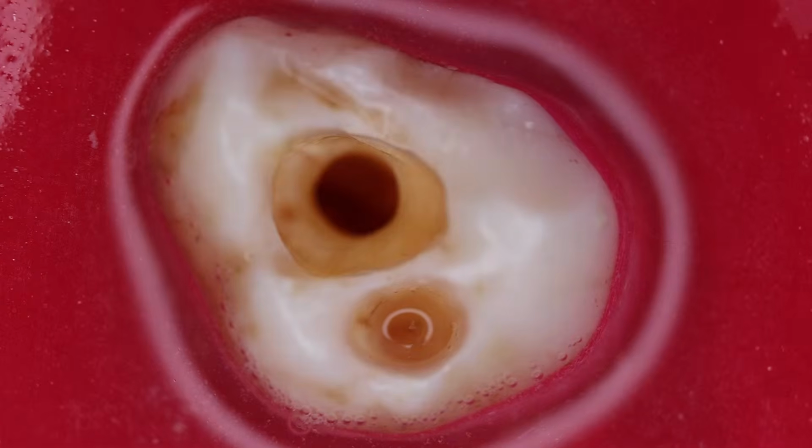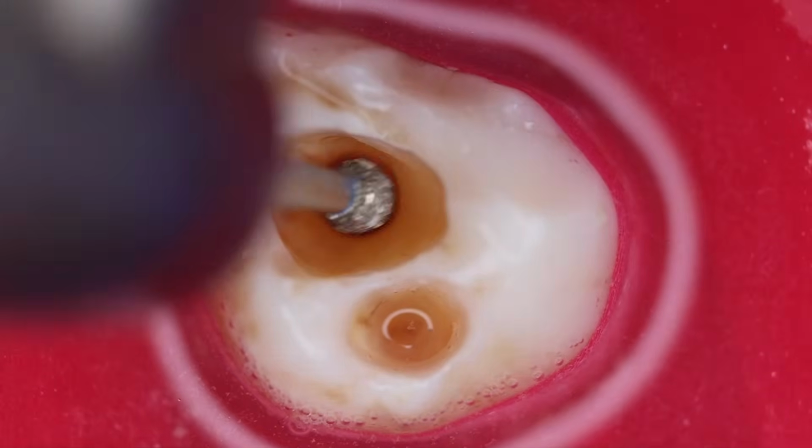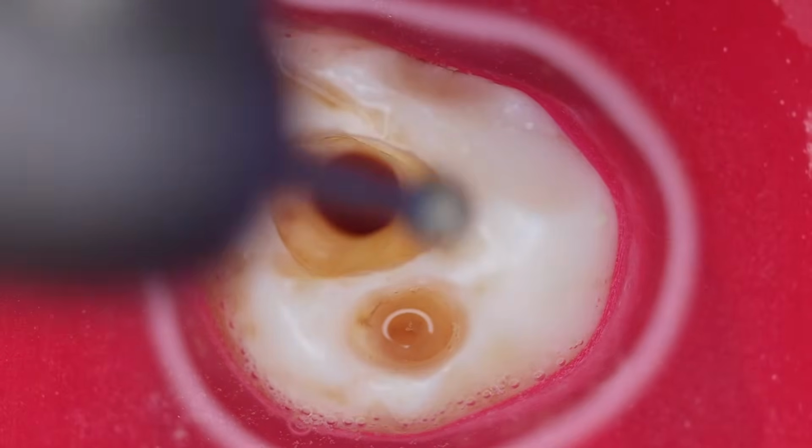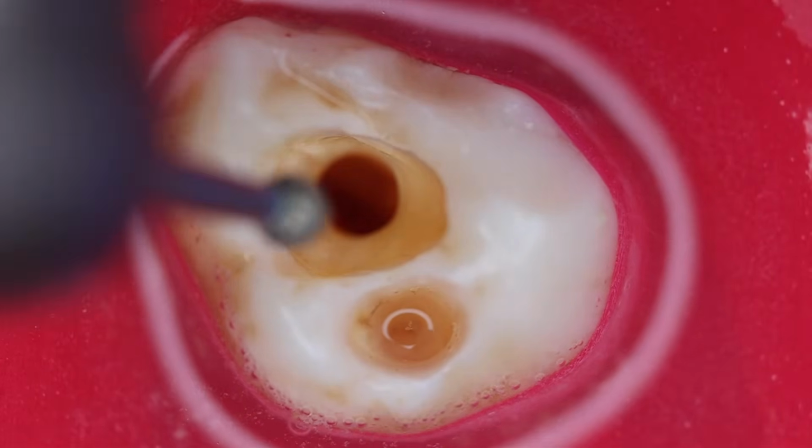And now we need to just remove the roof of the pulp chamber from all the aspects so that we can explore the canal orifices.